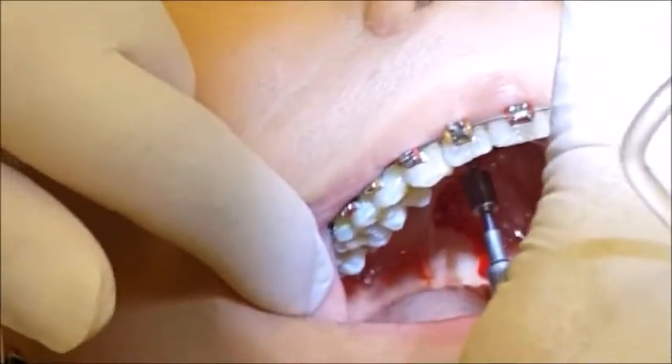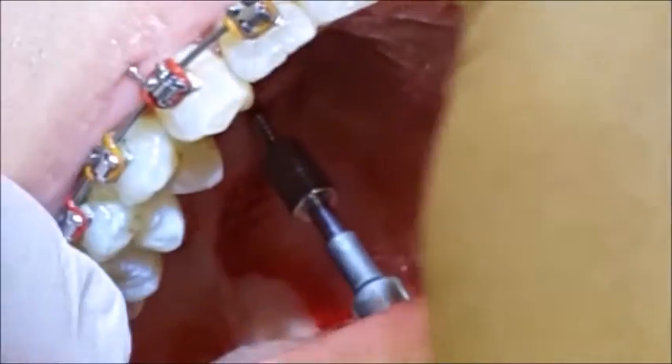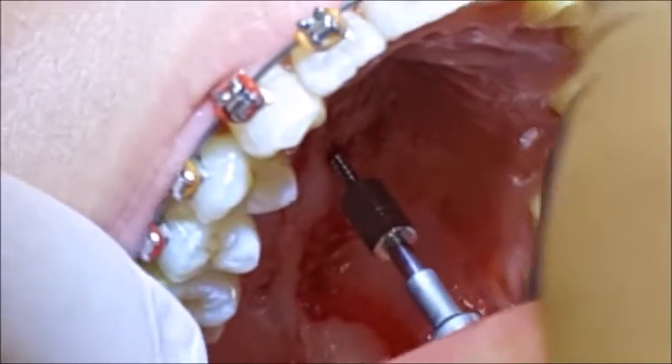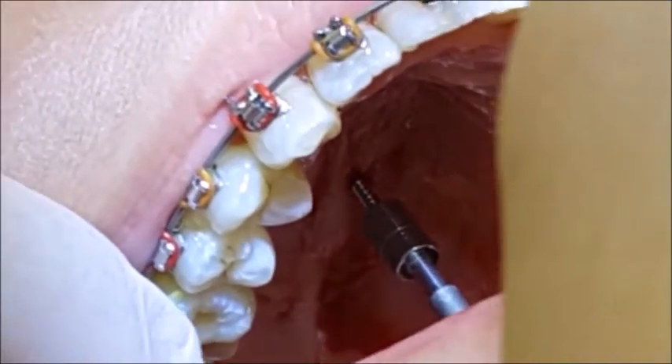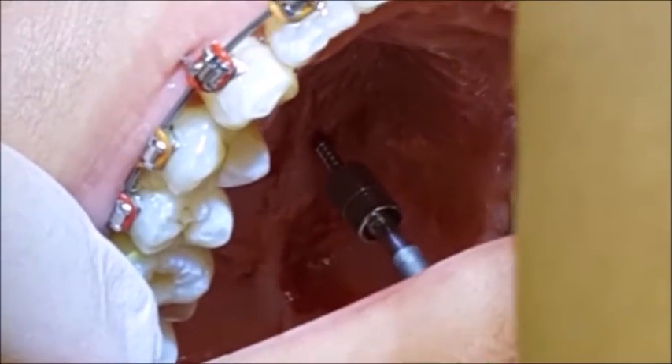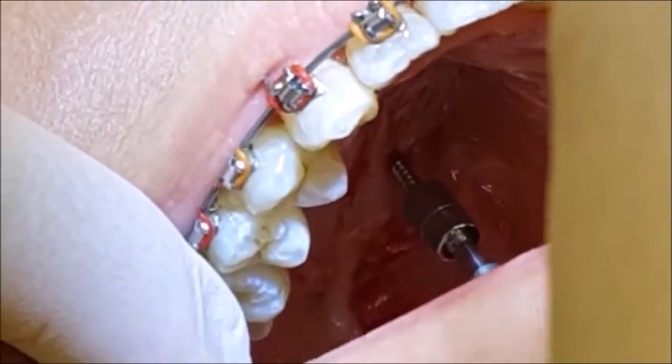We are positioning it at 90 degrees to the palate. Note that the contra angle has good clearance to the dentition, and we're starting to insert. We insert down to the base of the head; as the contra angle starts to contact the mucosa, we will stop the insertion.